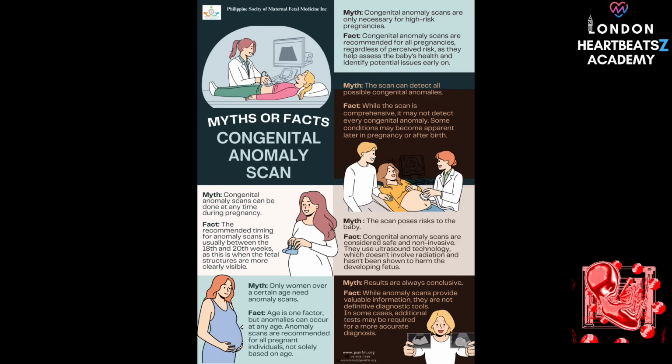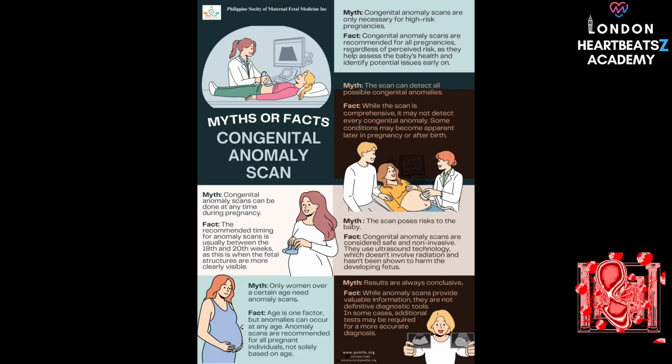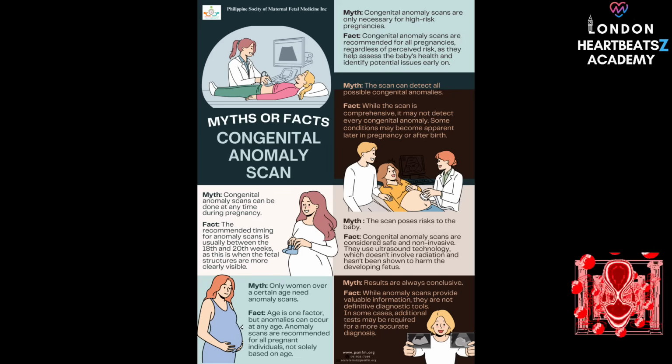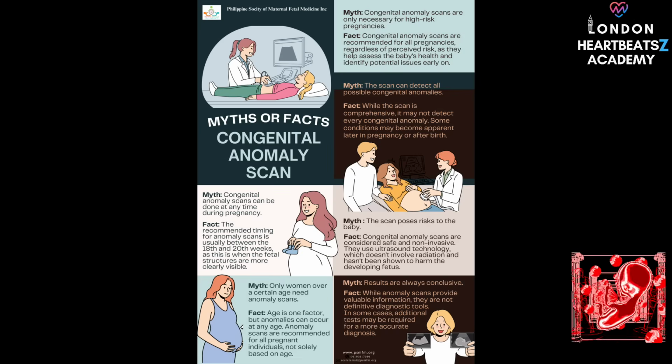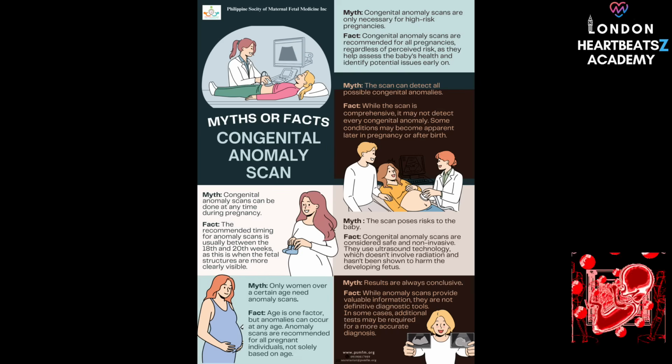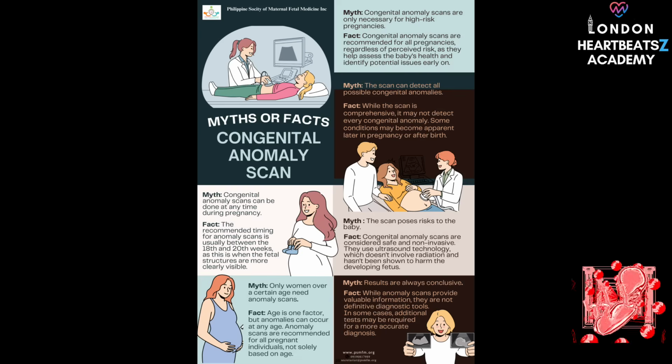Critically, it's about identifying any severe abnormalities that might be present. And importantly, even if a definitive diagnosis isn't made right then, the scan aims to raise suspicion for potential issues that might need further, more specialized evaluation, like additional scans, consultations with specialists, or other tests. So it's a screening tool, essentially, looking for the blueprint and flagging anything that looks significantly different.